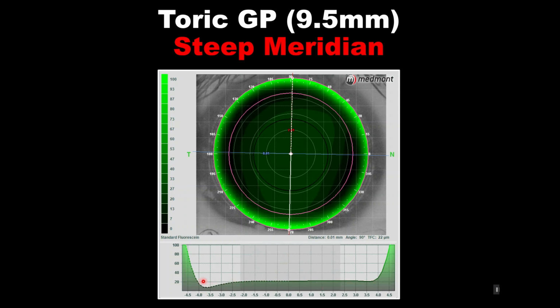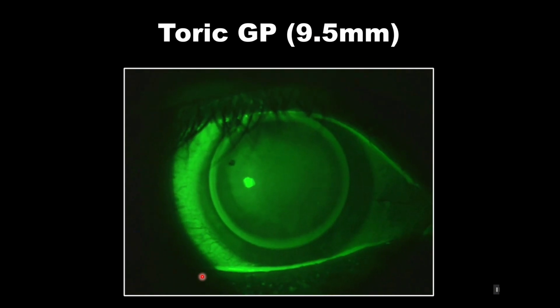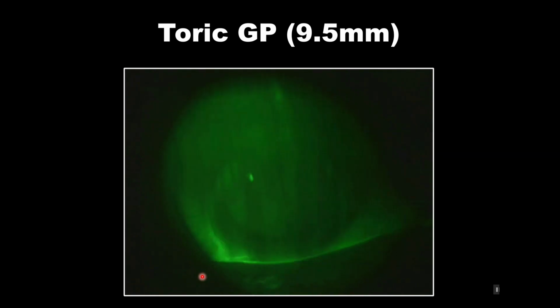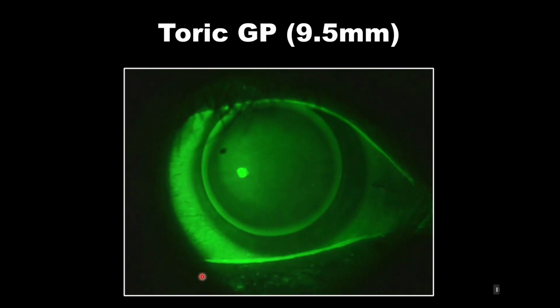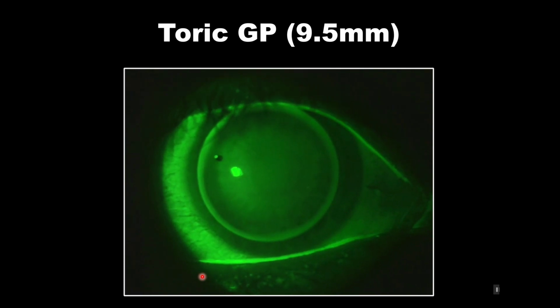Ideally, what I'd like to see is about 20 microns of fluid running all the way across the optic zone before the edge lift kicks in. Now, when we place that lens on eye, we see a good relationship both horizontally across the flat meridian, but also vertically across the steep meridian, giving us a quality centration of the lens as well as good movement and good tear exchange.